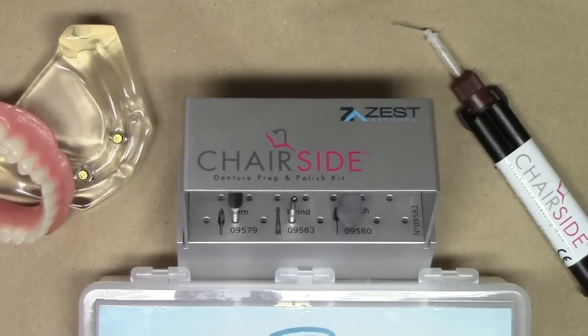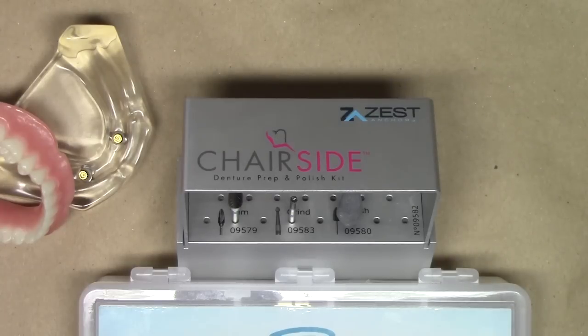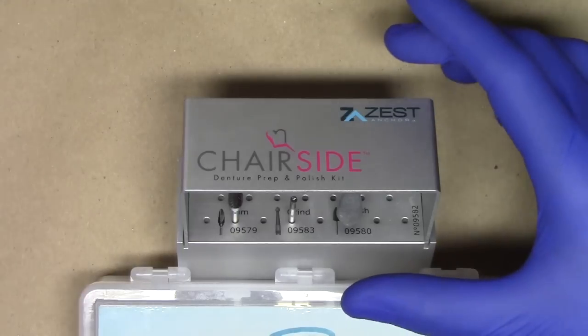Hello, this is Dr. Michael Scheer with LearnLocator, a free resource on how to treat, utilize, and maintain locator attachments for implant overdentures. The purpose of this video is to describe an exciting new product called the Zest Chairside Denture Prep and Polish Kit. In this technique demonstration, I'm going to be utilizing this burr block to process two locator denture caps into my complete denture utilizing the burr block and the Zest Chairside attachment processing materials.